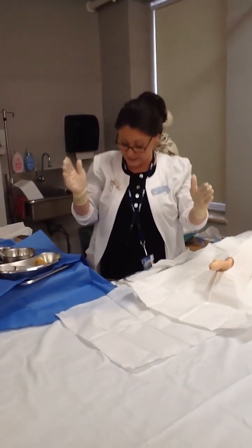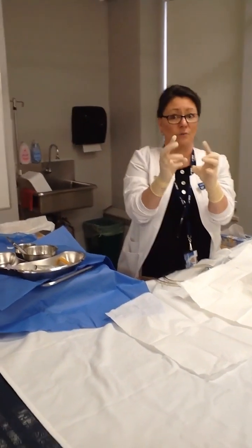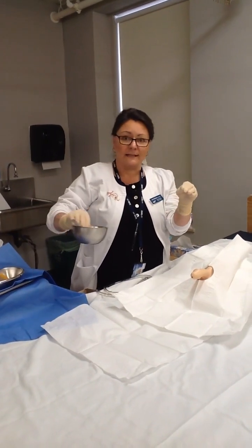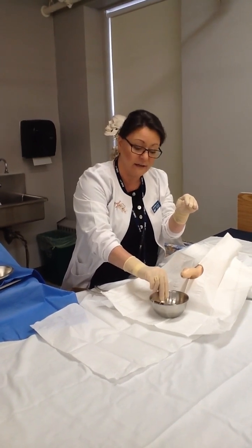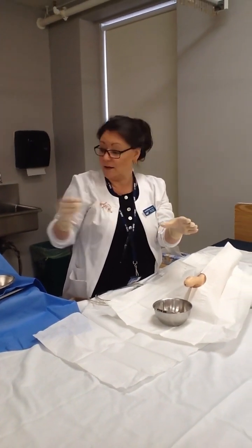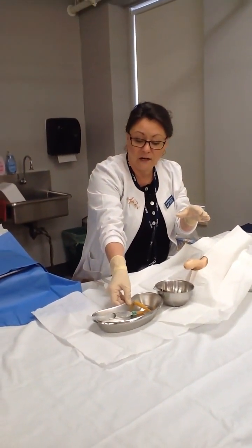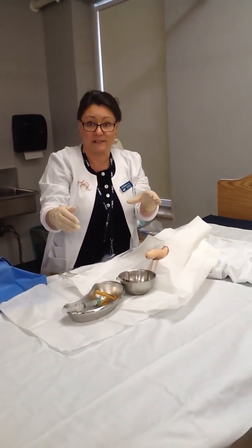So I'm ready to insert my catheter now. I'm keeping my hands very much in front of me. I want to know where they are all the time. I'm going to grab my bowl with my cotton balls, my sterile solution and my forceps, and put that right in front of the genitalia, because that's the first thing I'm going to do: cleanse the genitalia. Then I'm going to bring in my large emesis basin with my catheter already set up, right in behind there. You can note that I am keeping everything well within my sterile field.